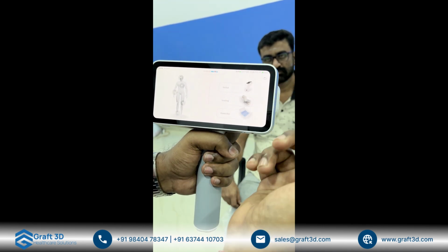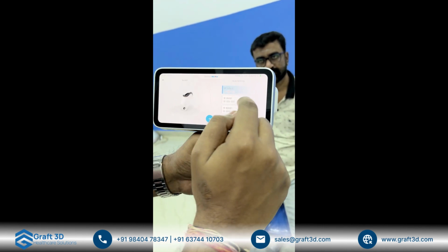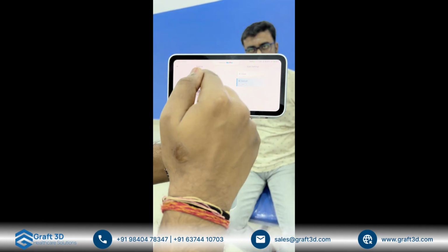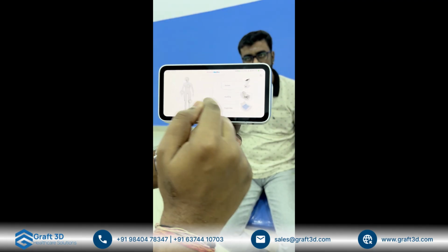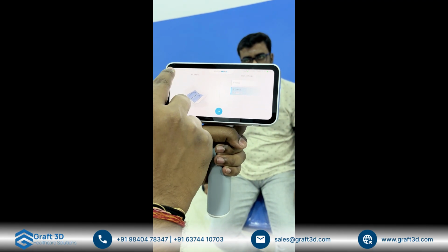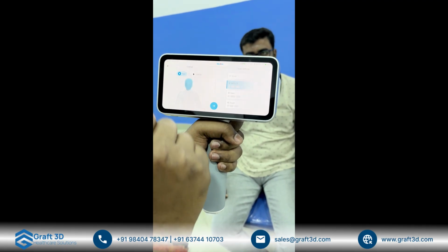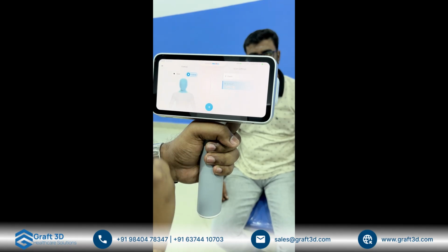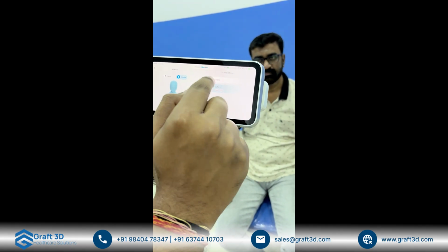If you want to scan a socket, we can directly scan a socket using different parameters. If you want to scan a seating, we can use a different mode of scanning, seating. And if you want to scan it with the help of a foam box, we can do that as well. So now we'll start with the face, or let's take it as a cranial. Over here, we have a different mode.